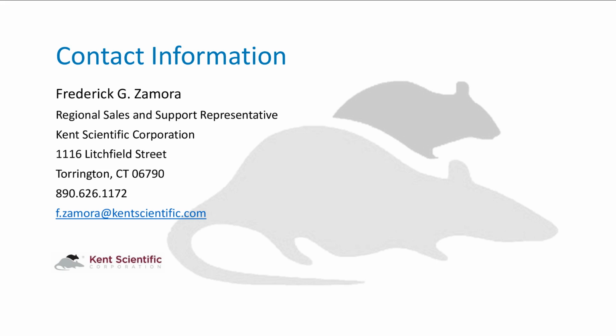And then any other carrier gas? Yeah, there's a second part of that. Any other carrier gas necessary, or is air enough? Gotcha. And there's a couple more after that. Any other carrier gas necessary? Nope. So when you are using your ambient air, the ambient air is enough for you.